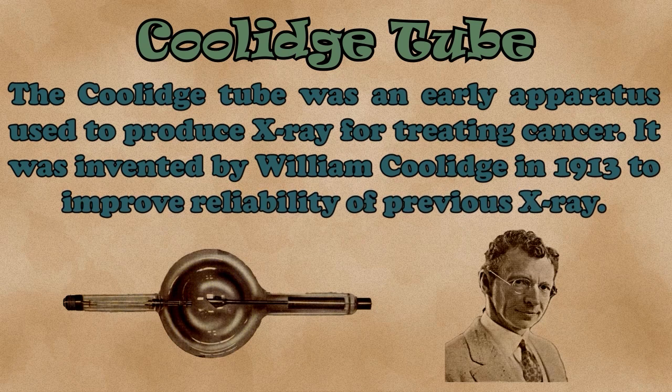Coolidge tube. The Coolidge tube was an early apparatus used to produce X-rays for treating cancer. It was invented by William Coolidge in 1913 to improve the reliability of previous X-ray tubes.